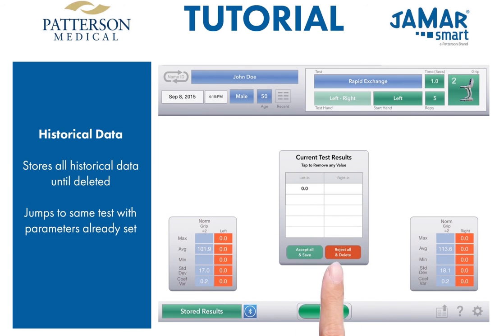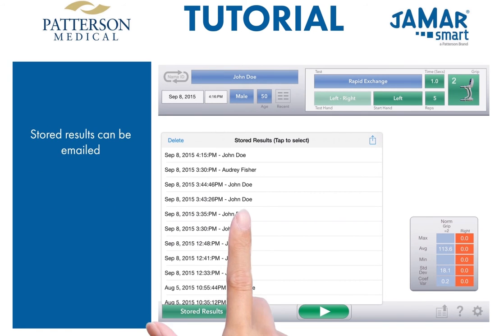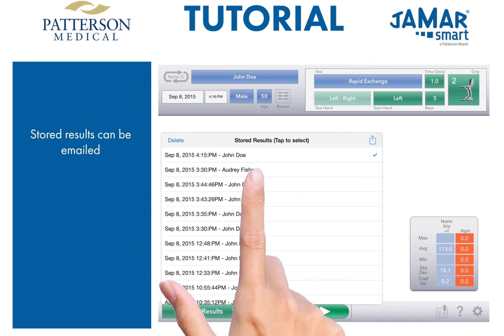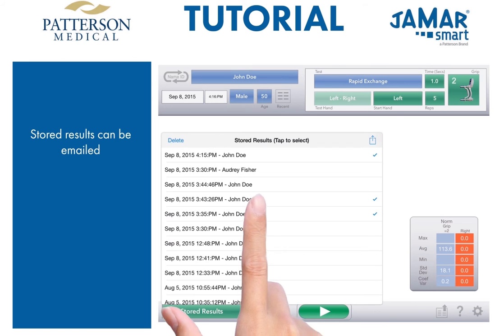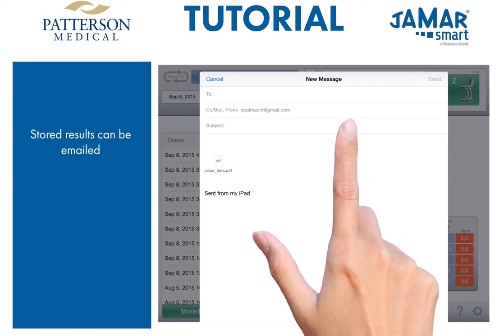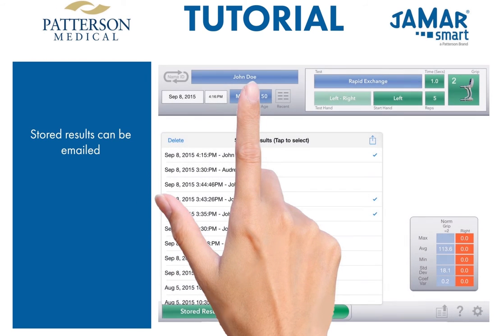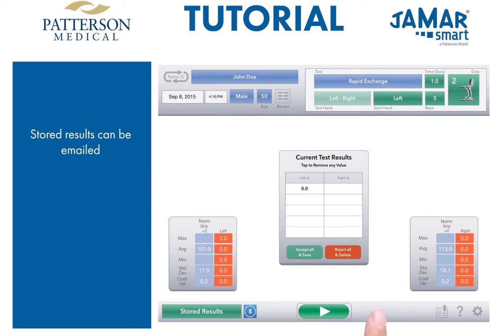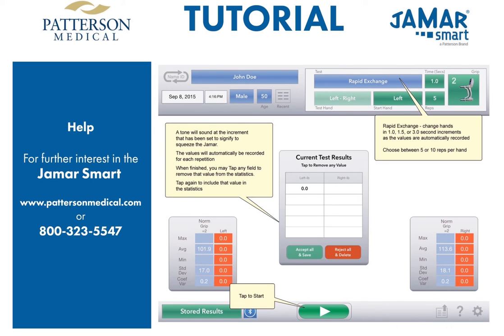At any time, the stored results can be emailed as a PDF file. Just tap the stored results you wish to email — each time you tap, a check will show up on the right. Tap the send icon when ready and just enter the email address. Every screen has its own relevant help screen — just tap the question mark at any time.